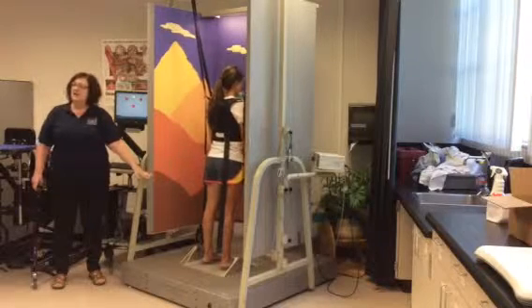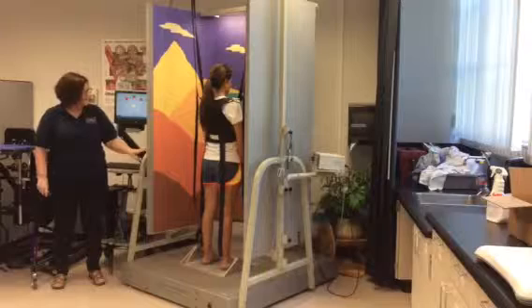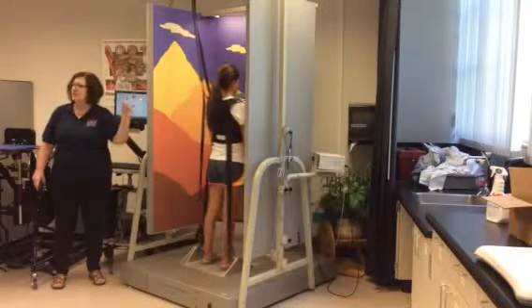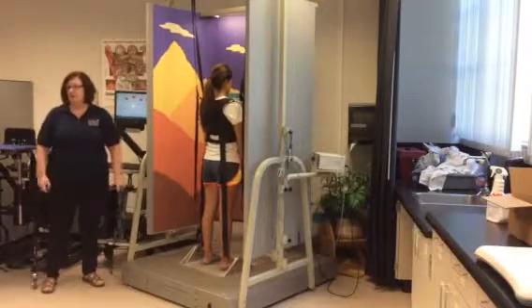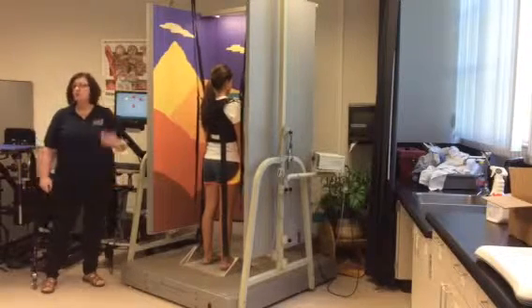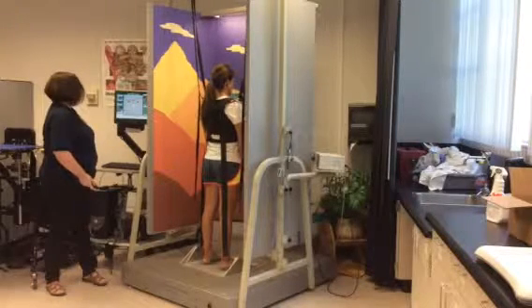I'm actually challenging her adaptation. I've got the floor moving unpredictably. I'm challenging her sensory. I'm challenging her motor in a task. You can't detect if the heels are off, right? You don't want the heels off, right? The computer can't detect it. You're watching, you're managing. Okay, so that was 20%.